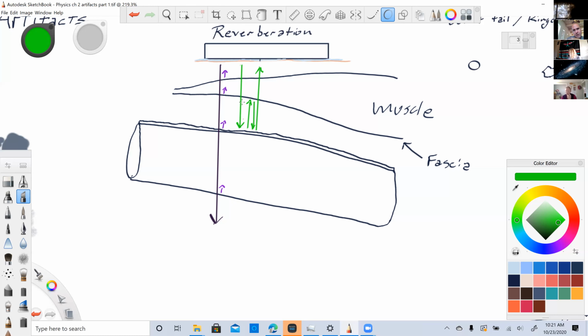He's going back and forth, back and forth. So there are different ways this reverberation can happen. I'm trying to think about what I just drew here. Got to be careful if I'm seeing that wall twice. So the way I drew this, I'm going to see the wall of the carotid artery again.